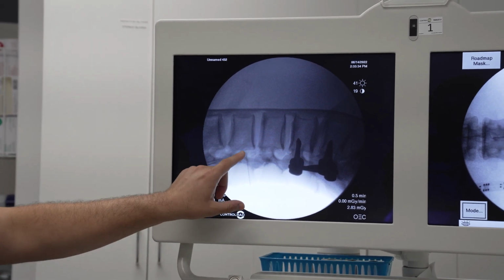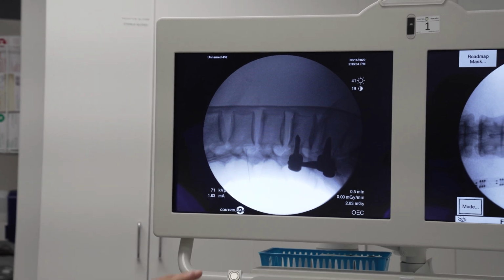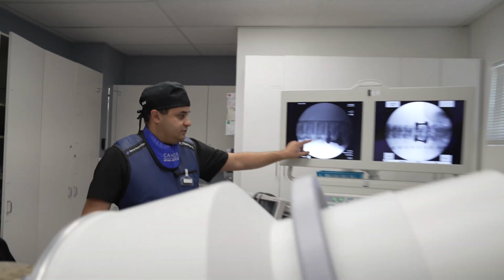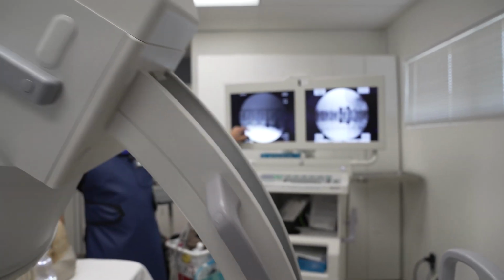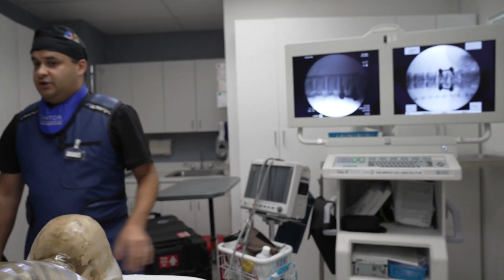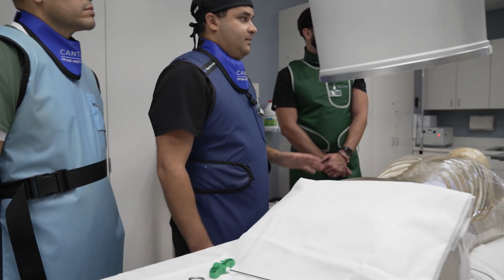And what we're going to do, all you check a lateral for is for depth. We don't put any contrast here yet. So we're going to come AP. So we know we're deep enough. Because sometimes you could be back here, you think you're in, you're not there yet. You want to be deep enough. You don't want to be too deep. If you miss the vertebrae, you can go past the vertebrae, and someone with different anatomy. You don't want to be too deep. So now we know we're here.